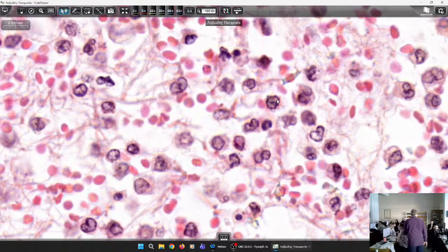So who wants to ask me and identify the cells of the inflammatory infiltrates? Now, you'll be the professor. Okay. Don't laugh. You must be strict. That's the way. So, show me, please. You'll show me all the cells, and I'll try to identify them based on the shape of the nuclei. All right. Show me one. The easy one first.